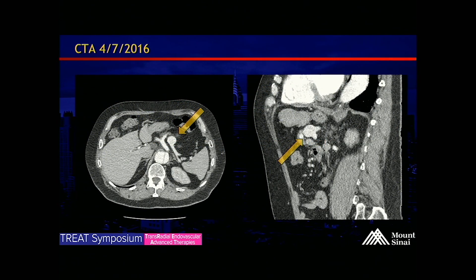As you can see on these two CTA images, the arrows are pointing to our saccular aneurysm. The inflow and the outflow are both on top of each other on the sagittal image. We currently have our catheter through the outflow of the aneurysm next to the splenic artery.